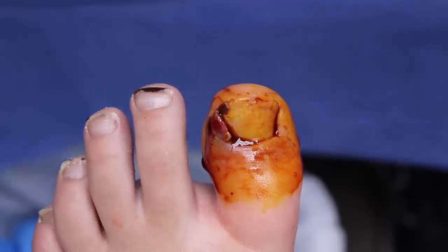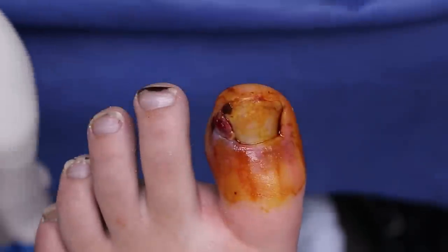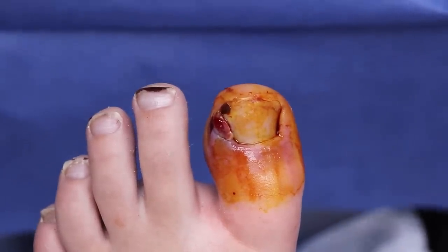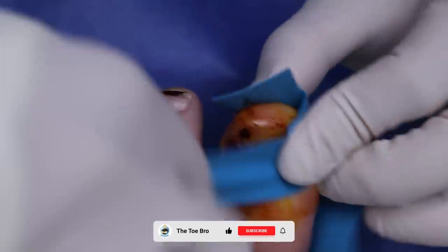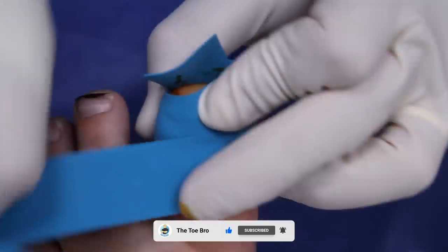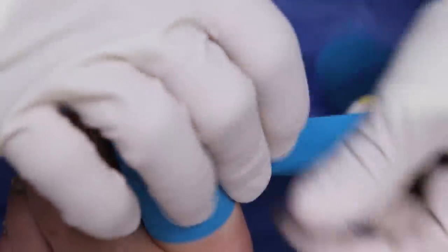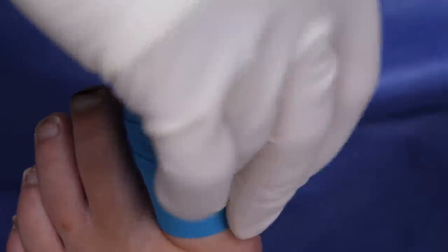You guys knew exactly who to send the photo to, huh? Oh yeah, absolutely — the only one on the list. So this is a tourniquet — it's a little rubber band to stop the bleeding so we can see what we're doing. That weird toe meat, hypergranulation tissue, bleeds like crazy. If there's too much blood during the procedure, you'll actually wash out the acid and it won't work, so this rubber band is very important.